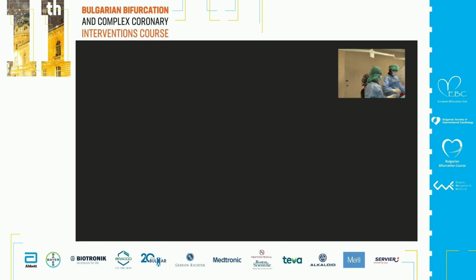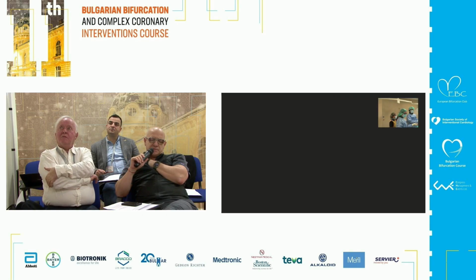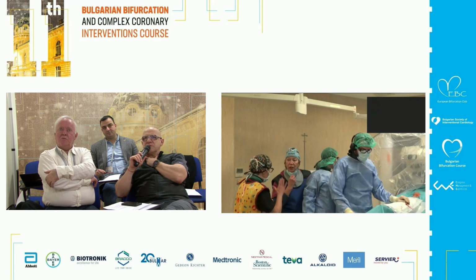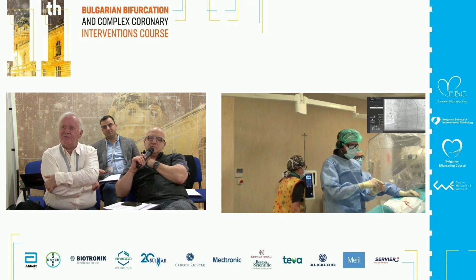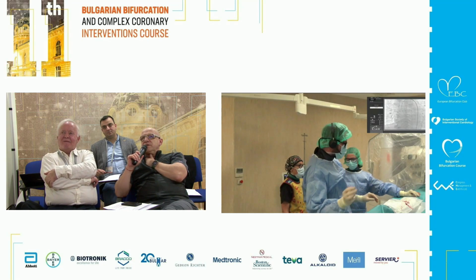So we have Dr. Chilingirov and Dr. Zheleva in the CAD lab. Dr. Zheleva is just proctoring. She is probably going to work with the IVUS. Okay, any comments, and what is your strategy to discuss and have the opinion of the panel here?